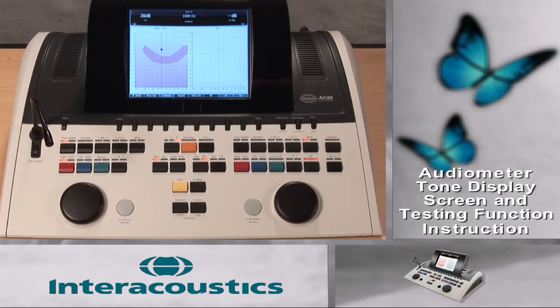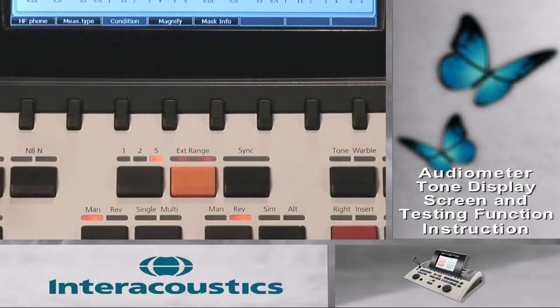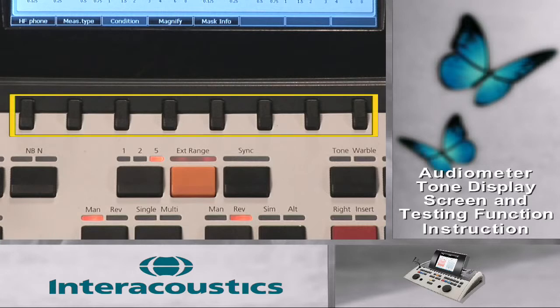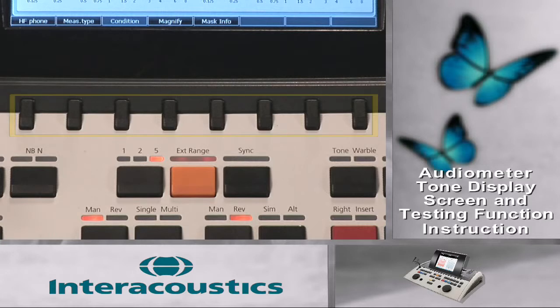Return to the video tutorial series for selection. The function key selection allows for increased efficiency with the audiometer and testing time due to simple selection from the main screen. It is important to know that each separate test screen will have a different set of function keys to assist the examiner.